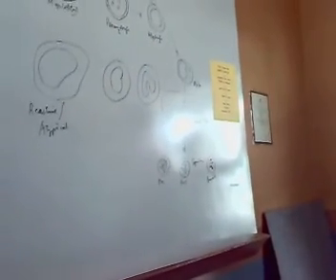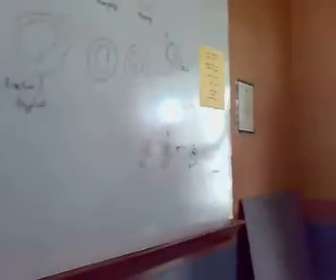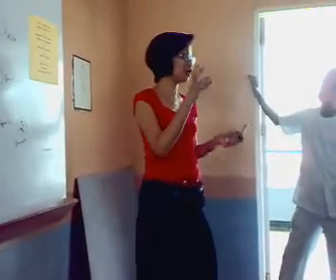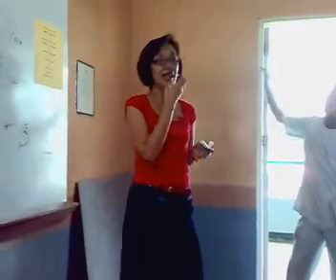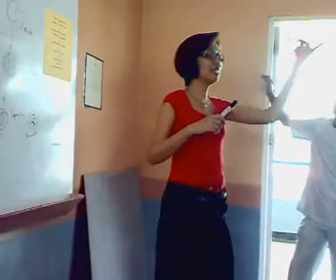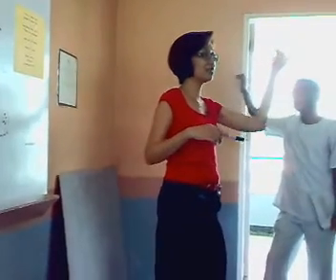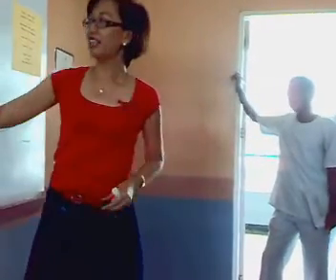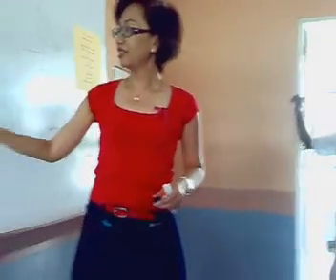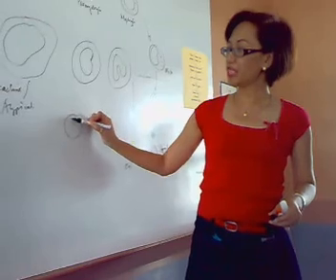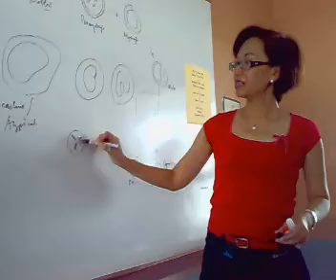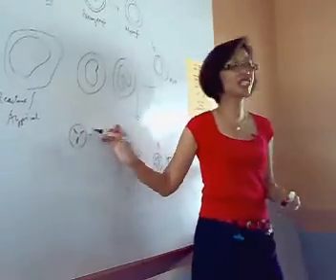You know what a red cell looks like. That's the red cell here. It has that central pallor. But then again, sometimes you have red cells without the central pallor. So you saw reticulocytes at the end. The reticulocyte under the supravital stain looks bluish. The reticulocyte stain is bluish, and you have those something inside. So this one's bluish.